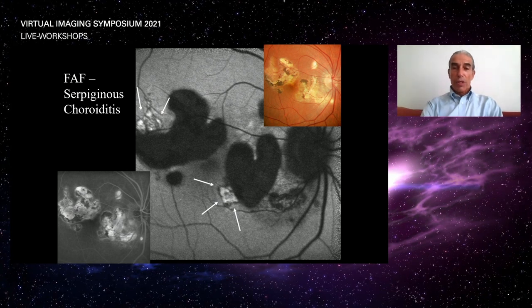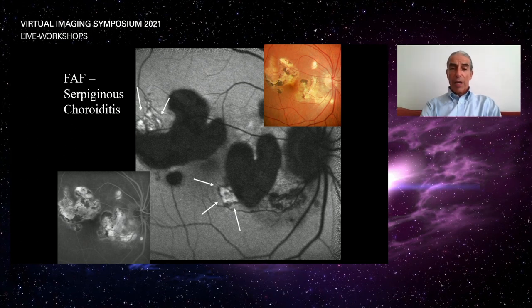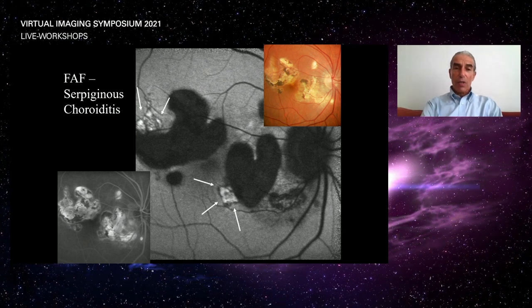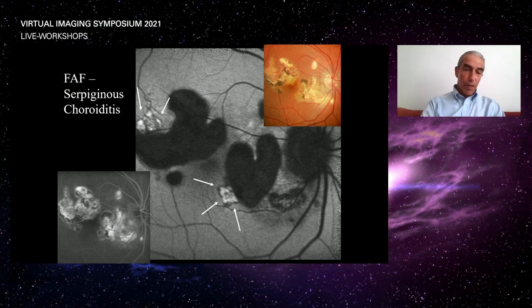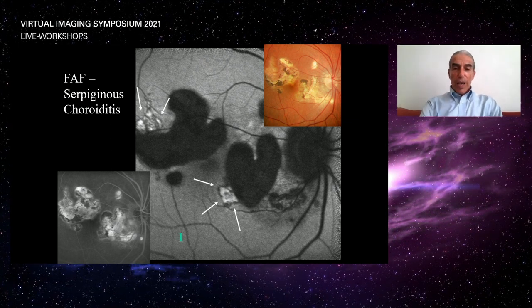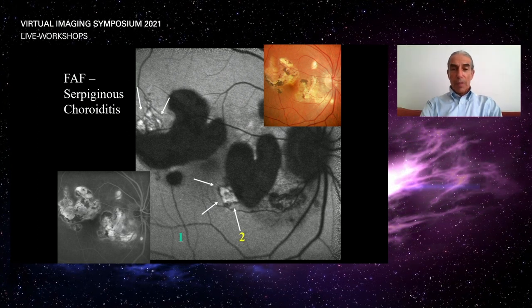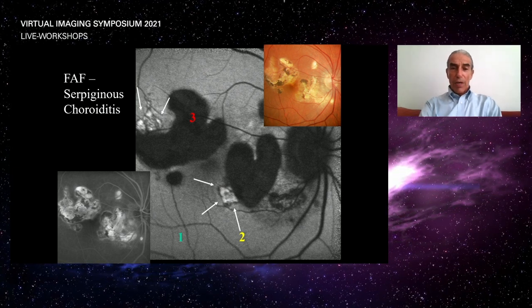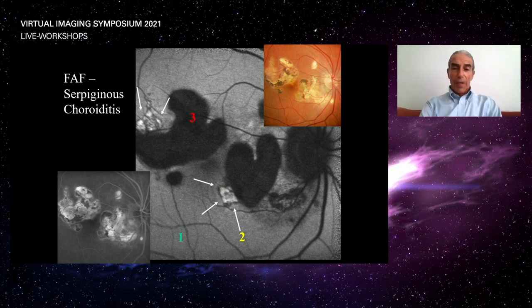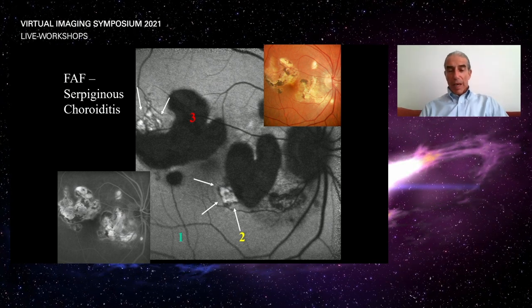We will go through this for a second, showing us that the dark areas and the gray areas and the white areas, each one of these different areas, the white, gray, and black, tell a different story. For starters, we have area number one on the bottom, which surrounds the central macular region. We have a number two white area and three black. And each one of these areas is basically an encyclopedia in itself explaining RPE health.